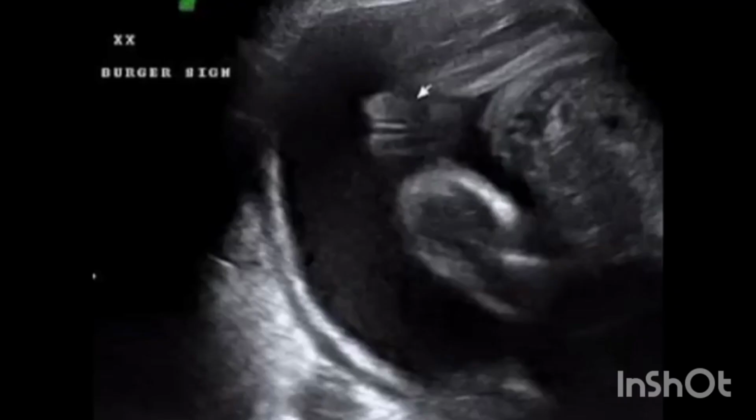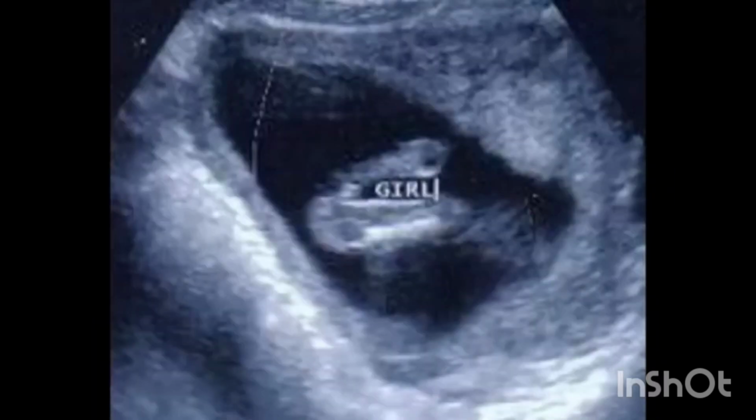This is another baby girl a bit further along into the pregnancy at 20 weeks. You can see the 3 lines, though not as clearly as some ultrasound images. Sometimes this lack of clarity has to do with the ultrasound equipment, the mother's weight, the baby's size. There are many factors involved in getting a clear picture from an ultrasound. The ultrasound technician has marked this one a girl as well.